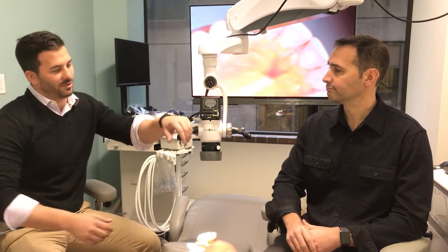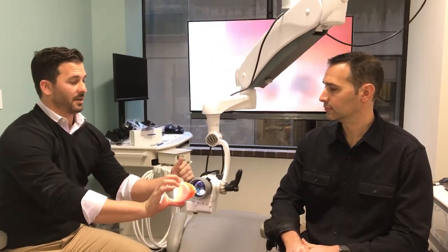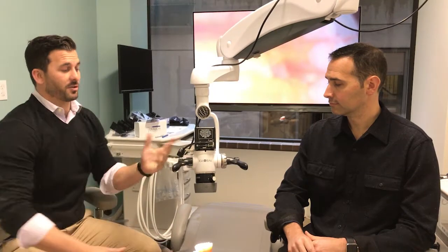Here you get the power of the microscope without having to be attached to the oculars. What's nice is you can just tilt it all the way back and you don't have to put your patient in an uncomfortable position. You can also put your radiograph on there side by side with a picture.